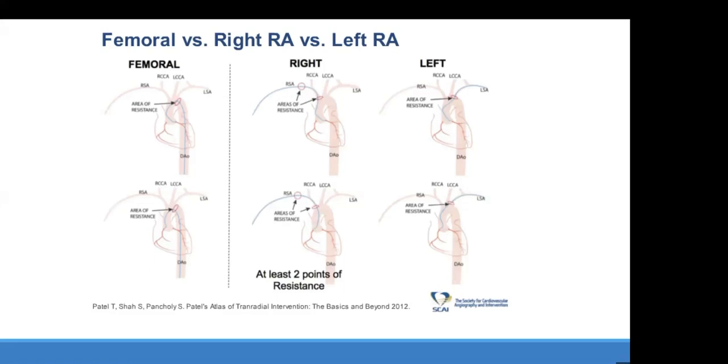I don't like it because it adds a lot of effort and time to the procedure. Prevention is the key for kinking, because once you kink, sometimes you even dislodge it completely and then you have to snare it. It's a long procedure. Personally, I've done it, and I learned how not to do it. So that's my advice for you: learn how to not kink.